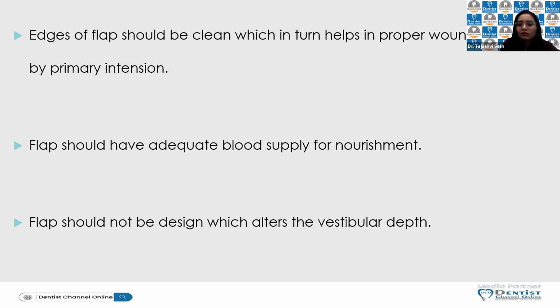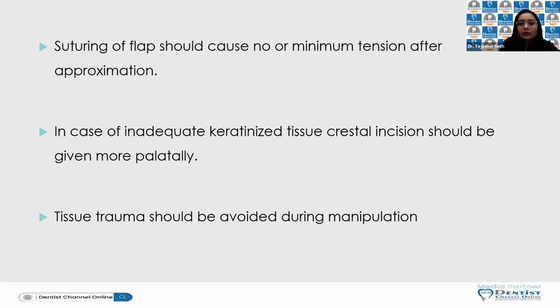And also, if the blood supply is good, your flap closure is good. Again, all this will ultimately help your patient factors as well as the outcome of your implants. The suturing has to be absolutely under no tension.